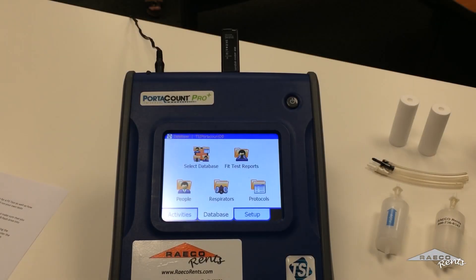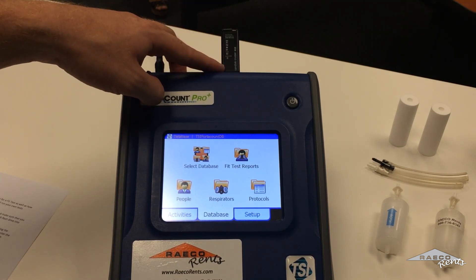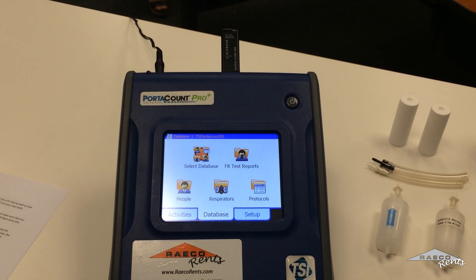So let's start with the basics. We're going to set up a database here. This is going to organize your data, make sure that you know who was tested, whether or not their mask passed. Make sure you plug in the USB flash drive up here — it's going to make sure everything saves to that so you can get your data later.